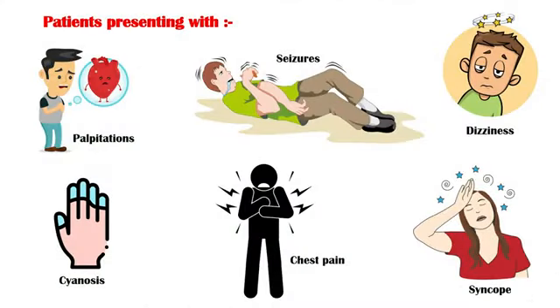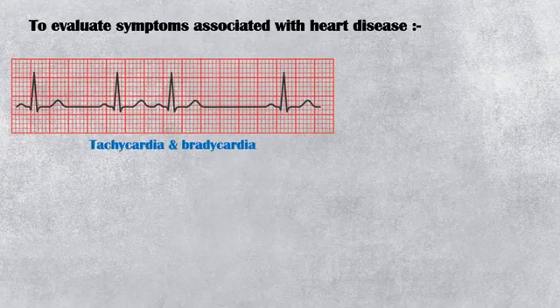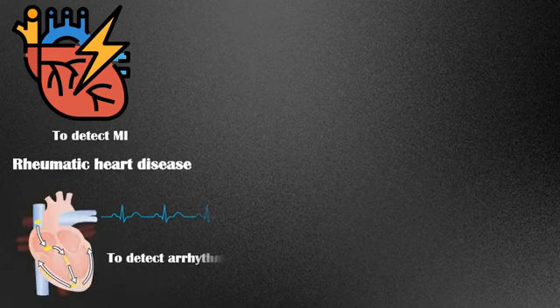In patients presenting with symptoms such as palpitations, dizziness, cyanosis, chest pain, syncope, and seizures. Symptoms or signs associated with heart disease, including tachycardia, bradycardia, hypothermia, murmurs, shock, hypotension, and hypertension. To detect recent and previous myocardial infarctions, rheumatic heart disease, arrhythmias and electrolyte imbalances.